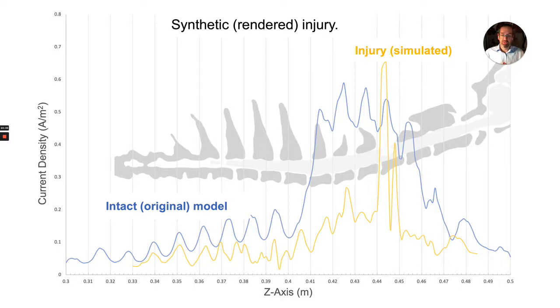Here you see an example of a simulation like that, where the blue trace is the standard anatomy. The electrodes here, you can probably guess, are roughly positioned over where you're seeing the electric field increase. You can see that oscillating electric field peak intensity that's defined by the anatomy and specifically the bone structure around the spinal cord.